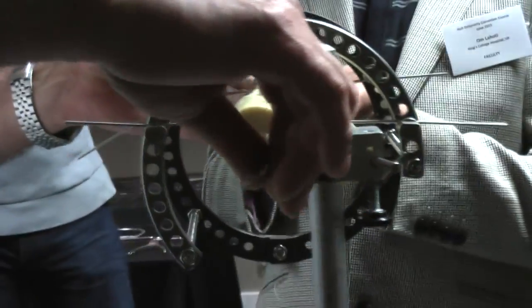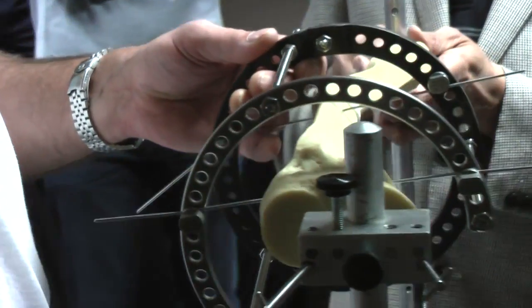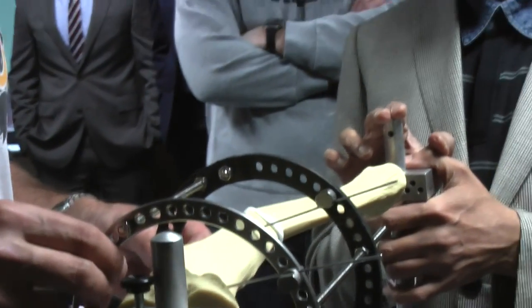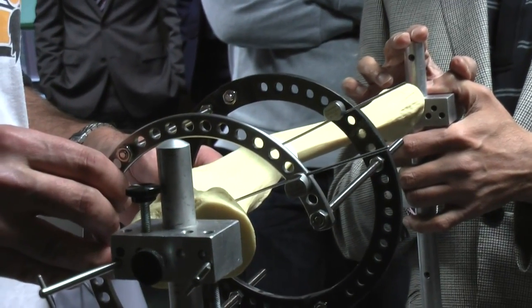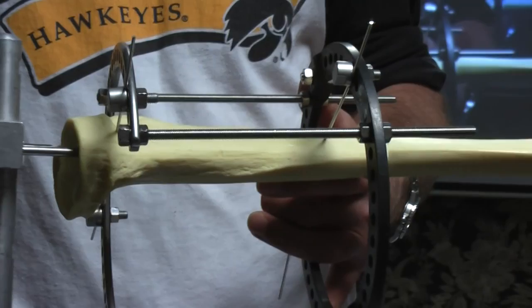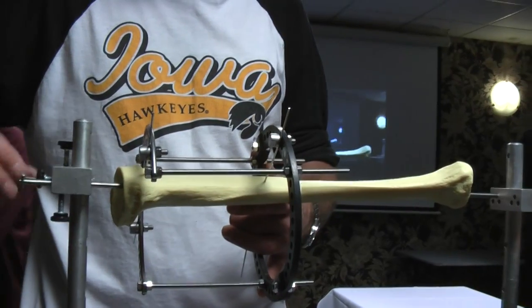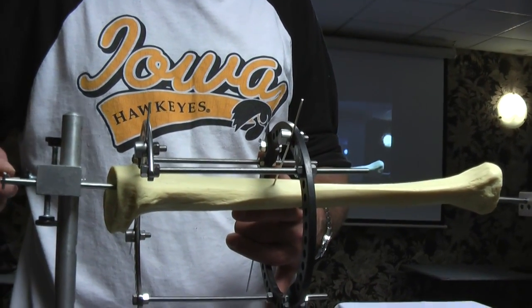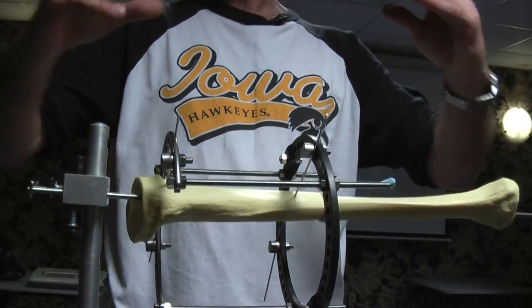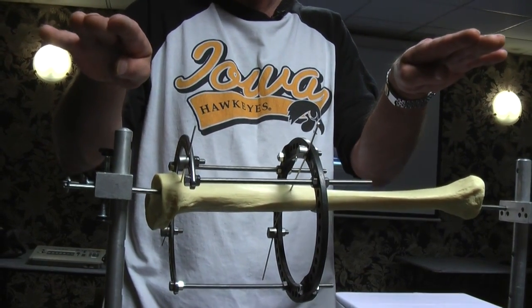All we're going to do is just rotate this bone until you, as my lateral projection, tell me the bone looks straight. Okay. Yes. There. That bone looks straight to you. So if we leave that there for now, I'll take your word on it, that as you take what is basically a lateral projection with this leg externally rotated, it now looks straight. Straight. It's straight. Yes. Good.